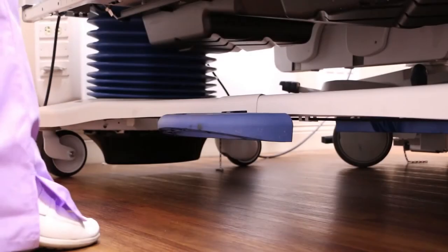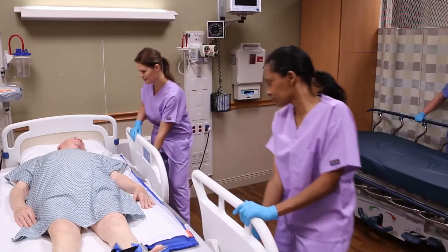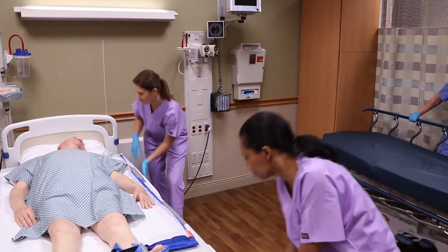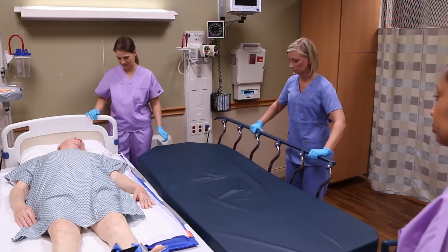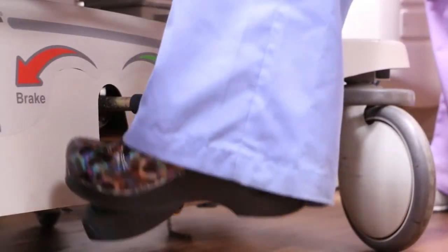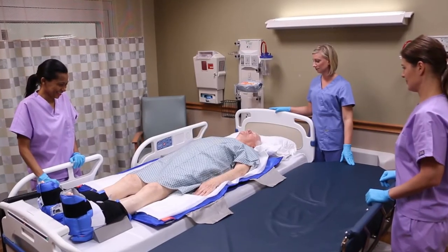To perform a lateral transfer, lock the brakes and lower the rail on the side of the bed. Lower the rail on the side of the receiving surface and move it as close as possible to the sending surface. Lock the brakes and set the receiving surface about an inch below the height of the sending surface.